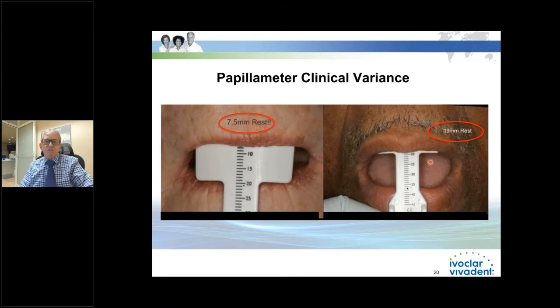Such a waste. When you have to move teeth, it takes so much more time to move teeth back or bring them forward or bring them down. So we want to do this in the occlusal rim stage. This is how important this is. You're going to want this customized occlusal rim. In fact, we always call that an aesthetic control base, an ECB, because it is a control. We've got measurements, we've made it customized for the patient, and it's ready to go. But look at that. I mean, big difference. 7.5 on this patient, 19.